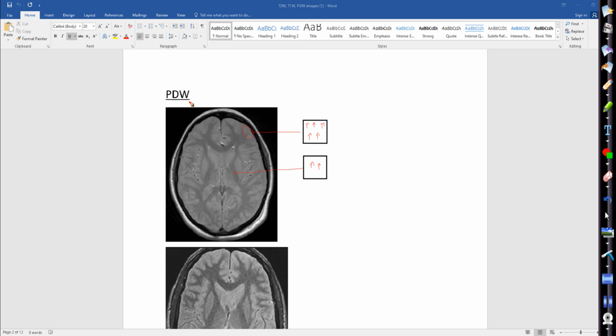So this image is created just based on how many of those hydrogen spins you have in a unit of volume. And we could say that fat probably has the most spin density compared to other tissues, just because it's the brightest on our proton density. So good.